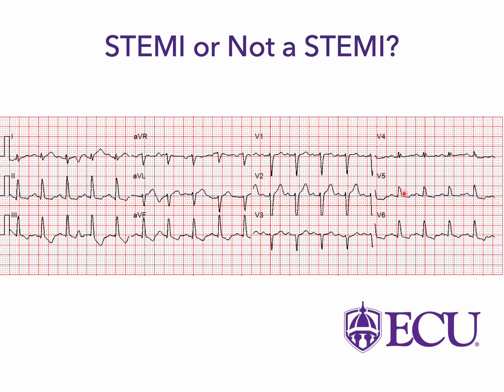There's some positive QRS complex here with a little bit of depression. We expect that. Same in V6 as well. We see that over here in the inferior leads. You have a positive QRS with some ST depression, positive QRS with some negative ST depression. So this is all looking like a pretty standard left bundle branch block. This would not be considered to be a STEMI.